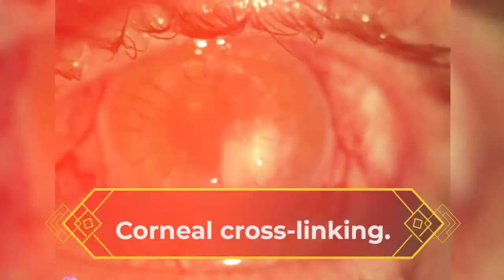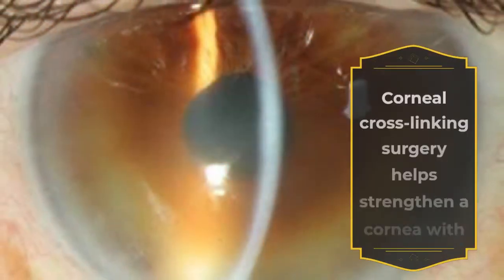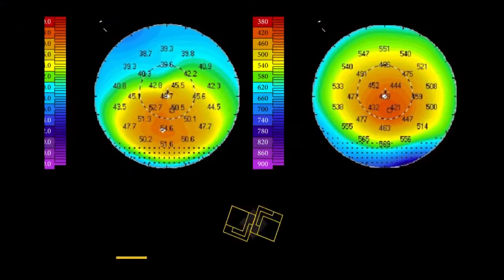Corneal crosslinking. Corneal crosslinking surgery helps strengthen a cornea with keratoconus. A topography scan may be done to see if this surgery is needed. After surgery, scans are done to monitor the eye.